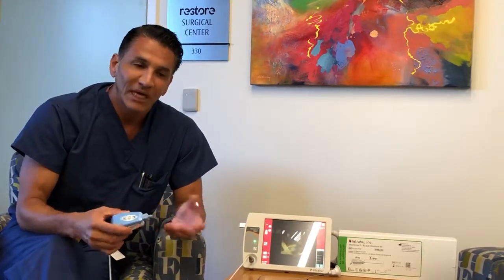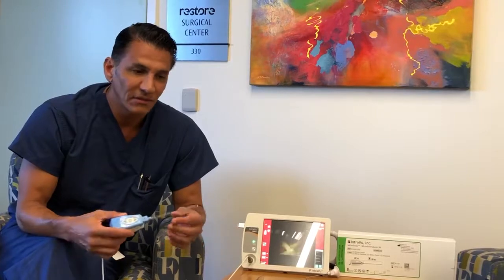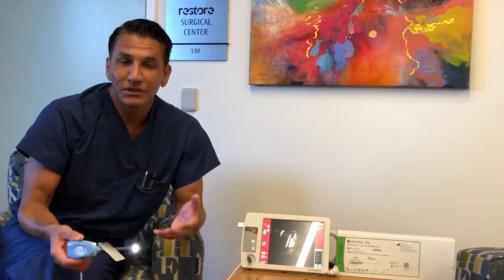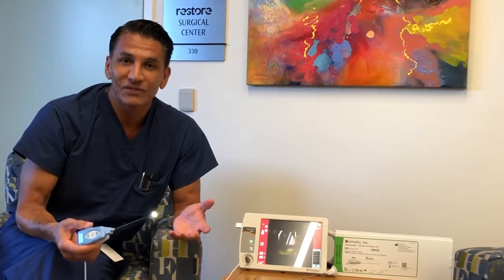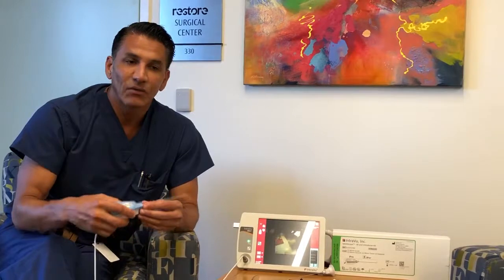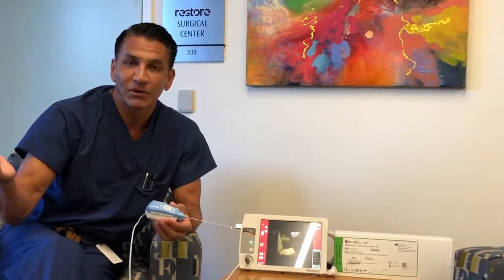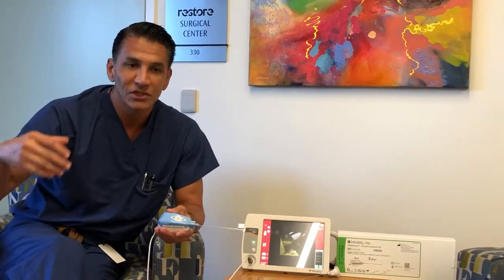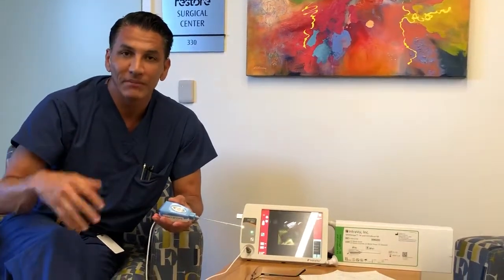You look at it, and if it looks like it's an obvious, high-grade delamination, then you can tell the patient, you're most likely going to need a cartilage resurfacing procedure, such as a MACI or an OATS. And with that information, the patient will know that they will have a long period of recovery, long period of crutches, recovery, physical therapy, non-weight bearing, etc.